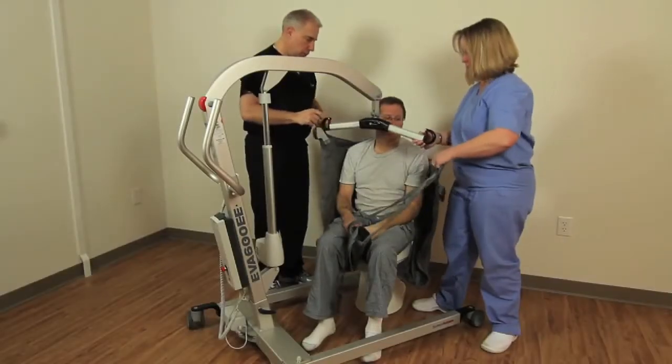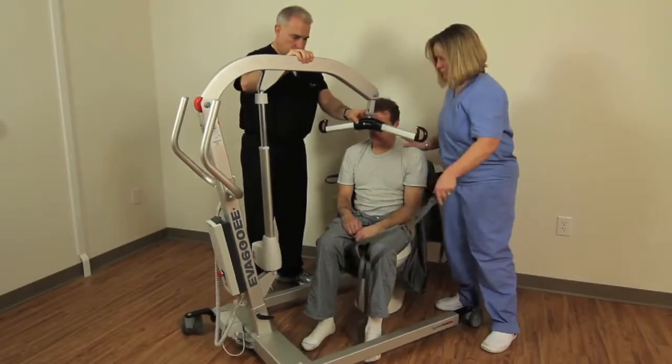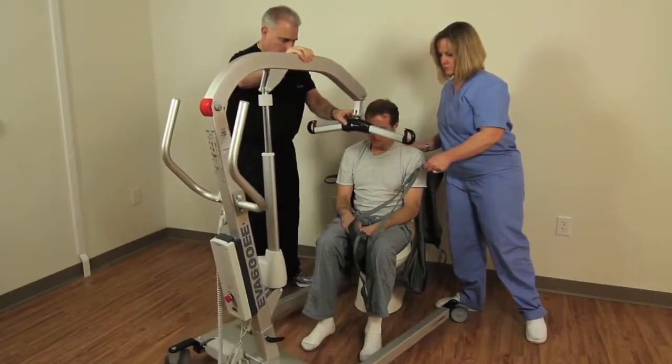Once the patient is lowered onto the toilet or commode, remove the sling loops individually from the sling bar. When all loops are free from the sling bar, move the lift out of the way.